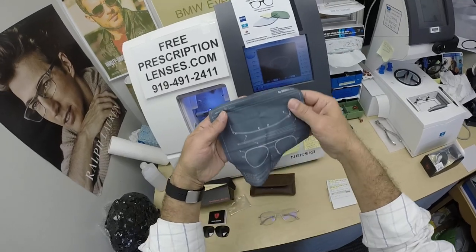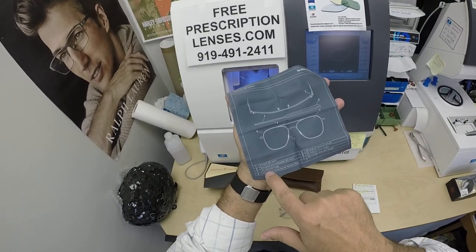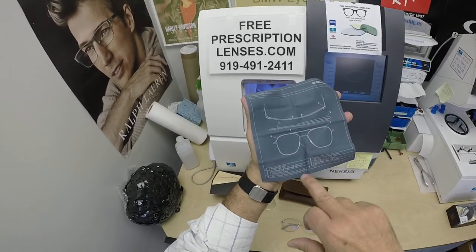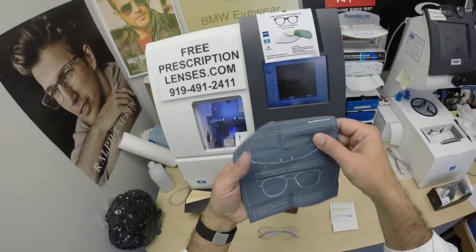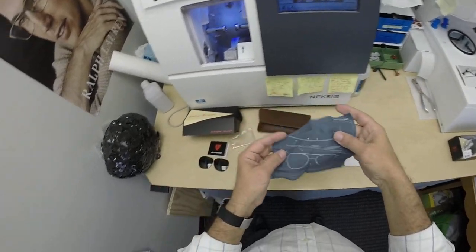They have put the blueprints of the frame onto the cleaning cloth. How cool is this? It gives you a description and the literal blueprints — how they break down everything from the nose pads to the shape to the bayonet temple to the printed mark on the lenses. I just think that's really cool. They do that for all their frames, and this one is for the original pilot.